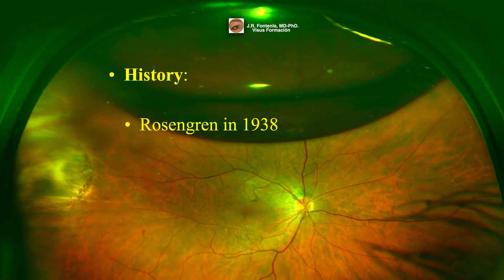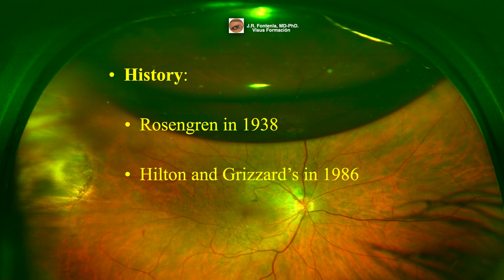The technique of repairing retinal detachment by retinopexy followed by gas endotamponade was first described by Rosengrin in 1938. However, this method was not widely practiced until after the publication of Hilton and Grissard's paper in the 1980s, in which they described what we recognize as modern pneumatic retinopexy.